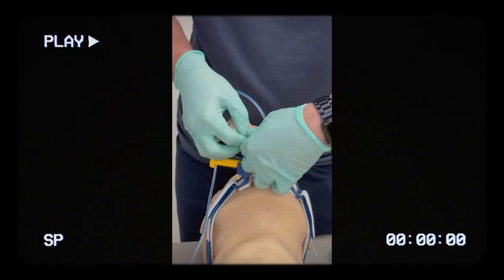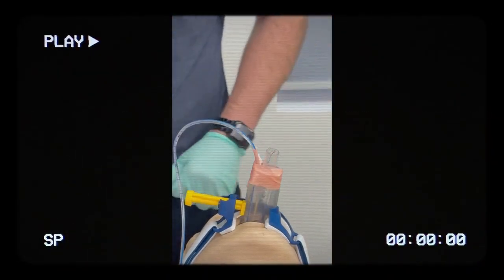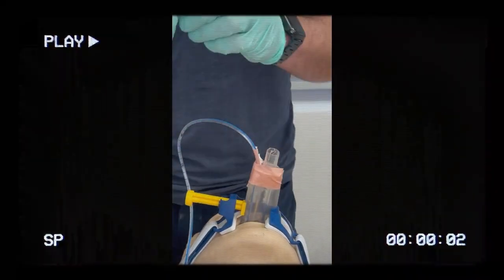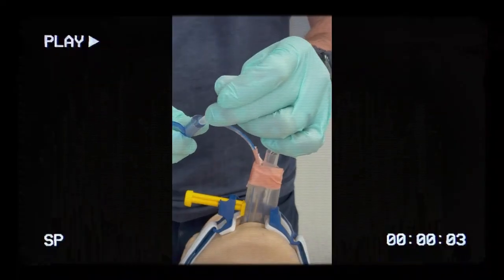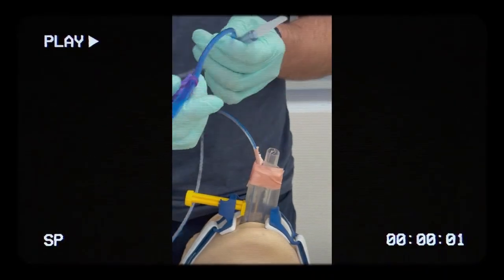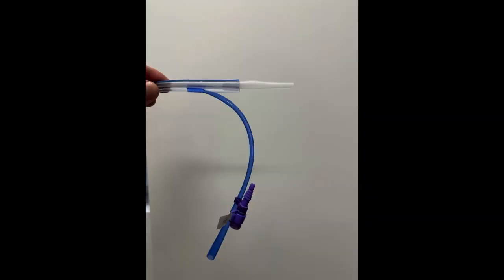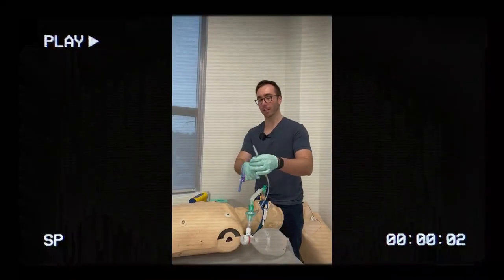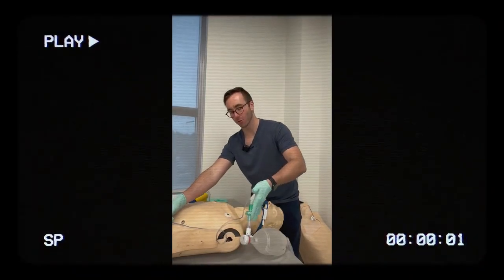Once at the correct depth, secure the catheter there — you don't have to move it up and down like you would for deep suctioning. The NG tube comes with a double-lumen catheter that goes into the port here. It's recommended to keep this part of the tubing open because it can actually drain gastric secretions and air. PPE is essential because you don't want gastric secretion in your face.